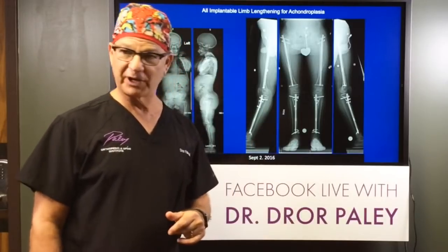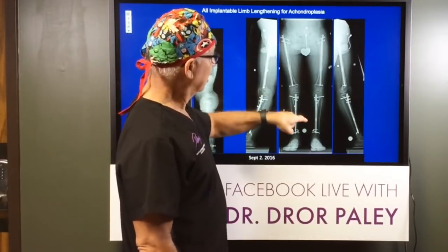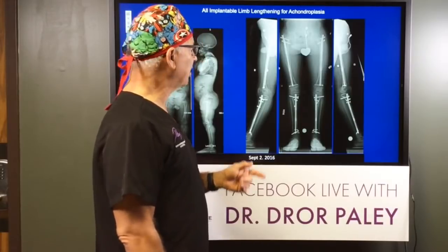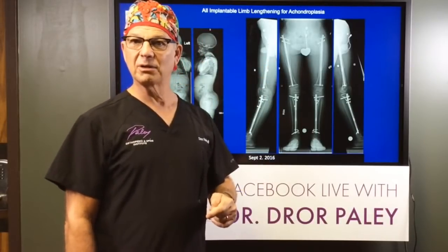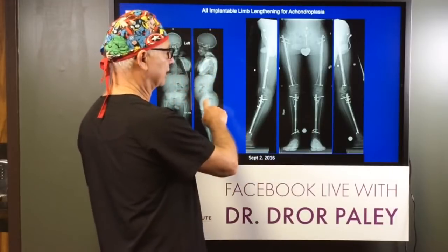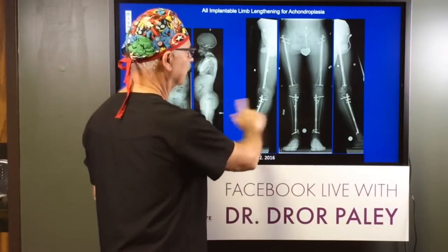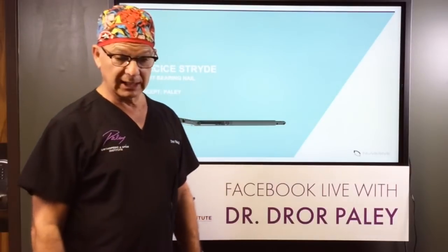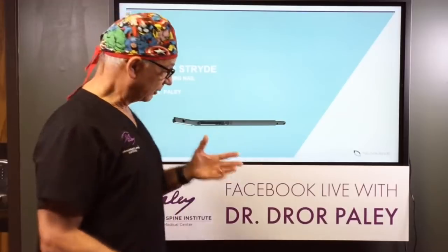This device, what's new about it, it's the first device that allows full weight bearing. So the previous device I mentioned was titanium. Titanium is flexible, and it's not strong enough to allow people to walk full weight on it during the lengthening. This device is. So this device was redesigned, different metal. It's a very durable, hard stainless steel called BioDur, and we changed the mechanism, changed a lot of things, so that the 10 millimeter diameter rod can bear up to 150 pounds, so we'll use that in people under 150 pounds. The 11.5 one can allow someone up to 200 pounds to walk without crutches, and the 13 millimeter diameter one up to 250 pounds without crutches.